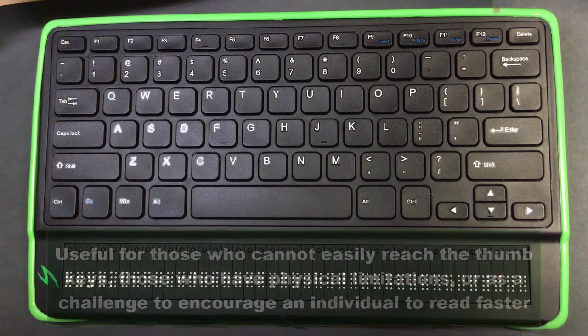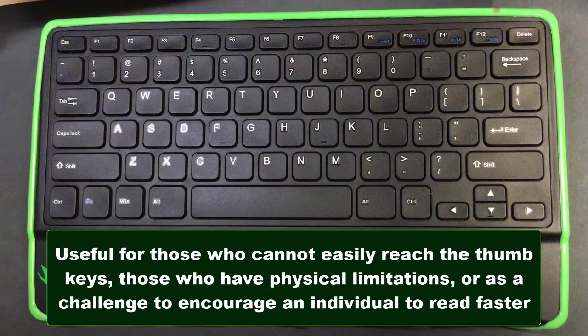It can be useful for students who maybe need an extra little bit of encouragement to read a little faster, if it's within their capability. Maybe the student has difficulty with their thumb reaching down to hit that next thumb key to advance the display manually. There could be a number of reasons for that to be something that they want to try.